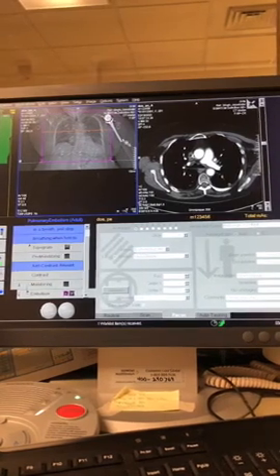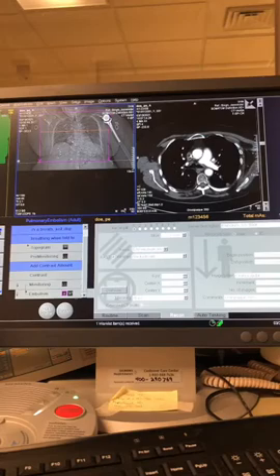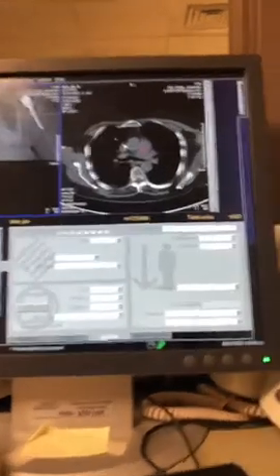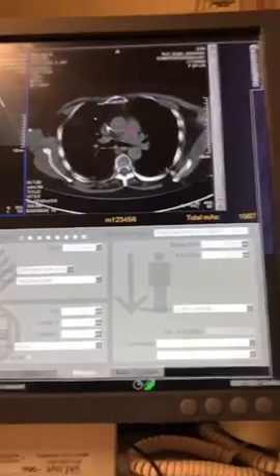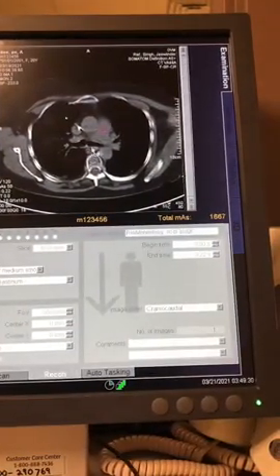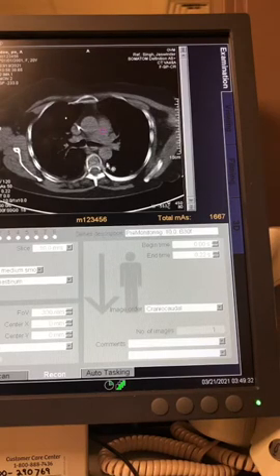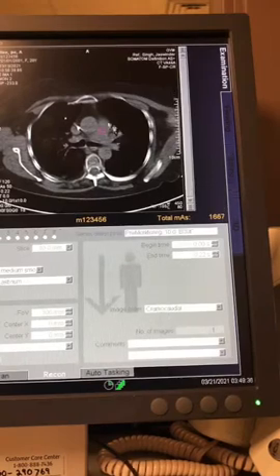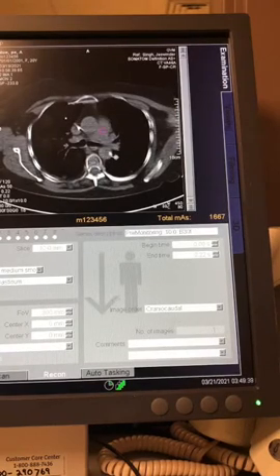So, all right, so we set up our scanning range, then we go to our pre-monitoring slice, which is this orange slice here, and then we come over. So I want you to look here at this picture. Now note, on our regular chest, we had our ROI here, right, which was in the descending aorta.